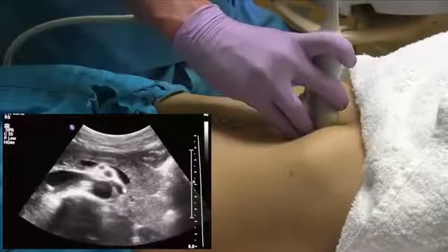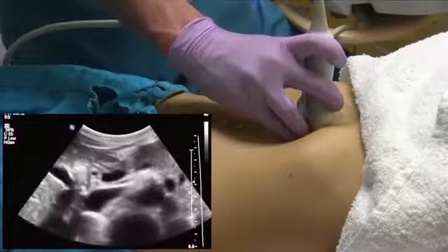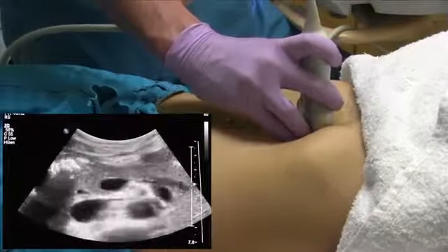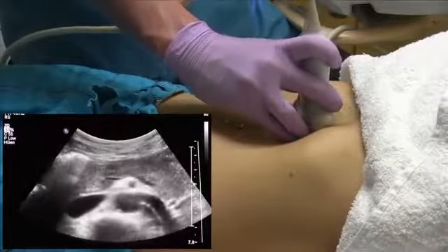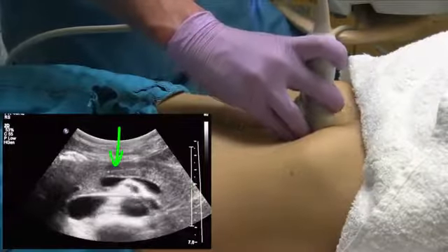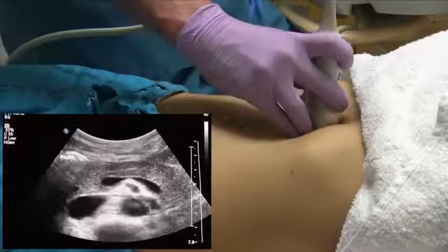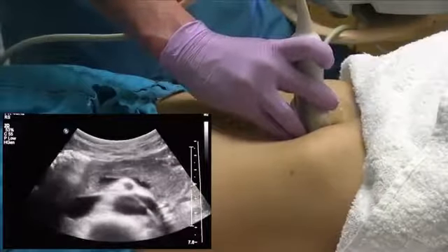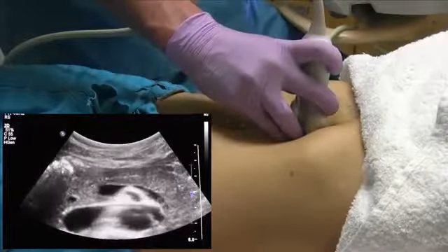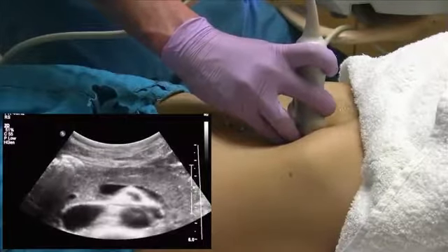When you're looking at the pancreas, you want to look for certain structures as well. One of the structures that we can look for is the pancreatic duct, and that runs right through the body of the pancreas, throughout the entire length of the pancreas. In a lot of patients, you will be able to see the pancreatic duct, and we usually use 2 millimeters as a cutoff for our normal pancreatic duct measurement.